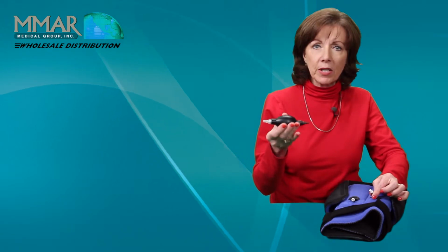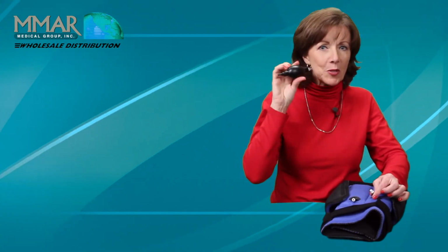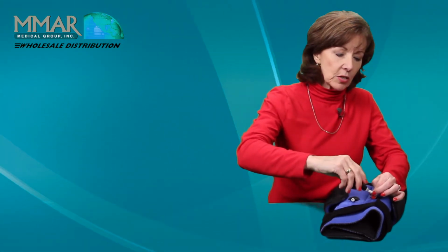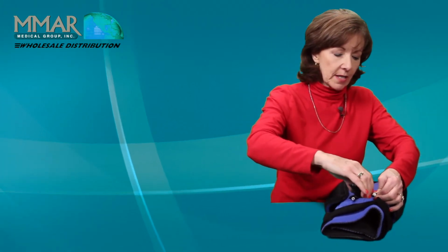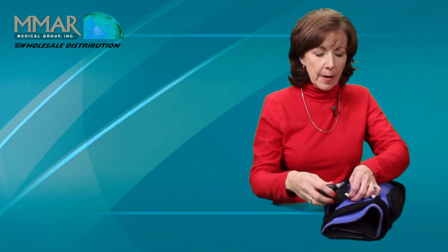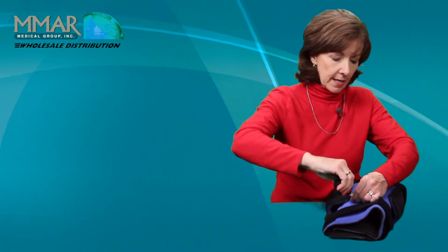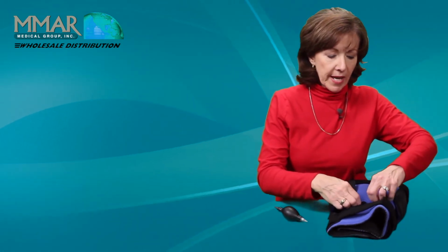Now here's the hand bulb that comes with it. If you forget which one pumps, you can do this and feel the airflow. It's the clear one. Insert it and begin to pump. Now again, this is not orthopedic. You don't have to worry about how many you pump. You can count them if you want, but it really isn't necessary. You're just going to watch and see how much they're elevated. You're going to tuck these back in.